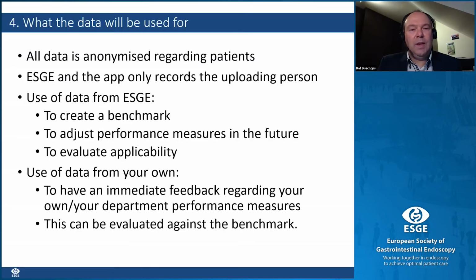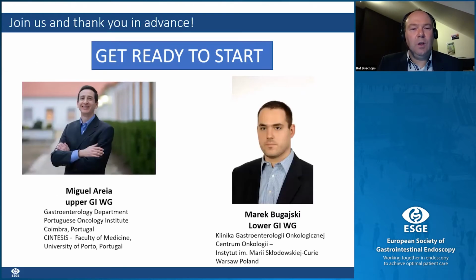All data are protected. There's no patient data that are kept. We only record who's uploading, so we can develop a benchmark for the quality indicators, and we also will adjust the performance measures in the future based on the output of this system, and we also evaluate the applicability. From your side, you'll get an immediate feedback on your quality in your service, and if it's ready, we can evaluate it against the benchmark. So now get ready to start.